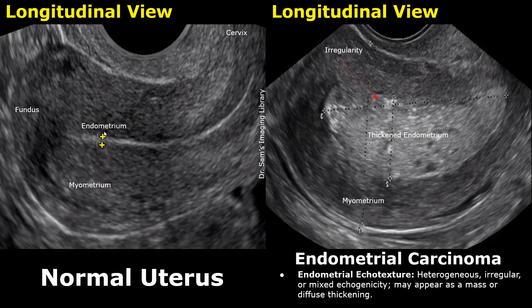These images are transvaginal images, which provide better detail. In the normal uterus, the echogenic endometrium appears as a smooth curvilinear structure, and the second thick layer is the myometrium. The upper part of the uterus is on the left in this longitudinal image — the fundus — and the cervix is the lower part of the uterus, seen on the top right side in this image.